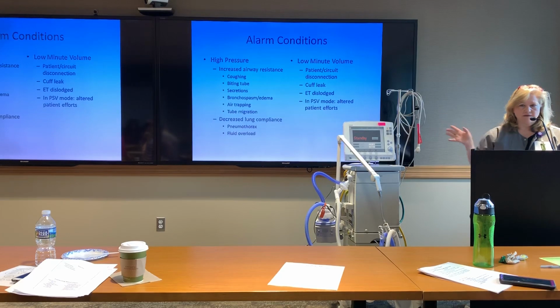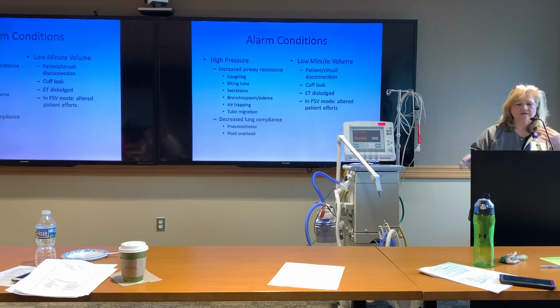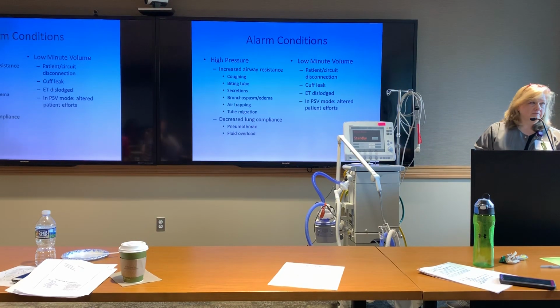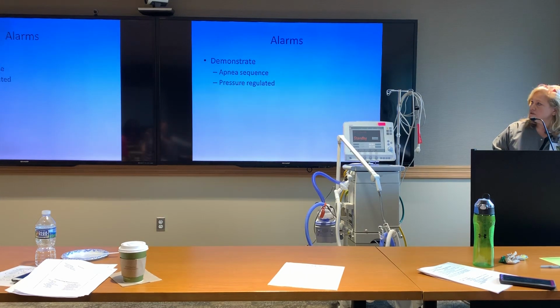You can just do it by ear and sight, and sometimes you've got to look real carefully to see which breath is coming first, the patient or the vent, but it's certainly something to pay attention to. Those are the main alarms. I already demonstrated the apnea sequence, and I talked to you about pressure regulated.